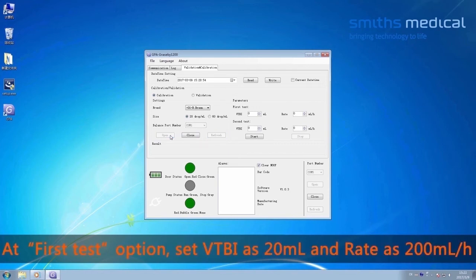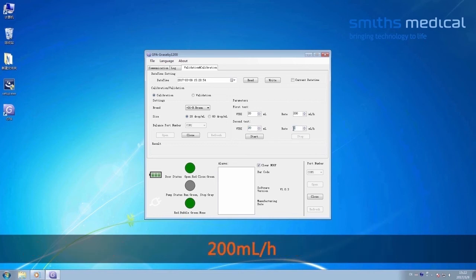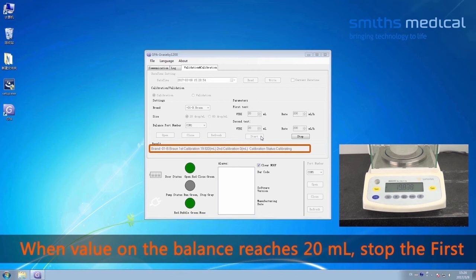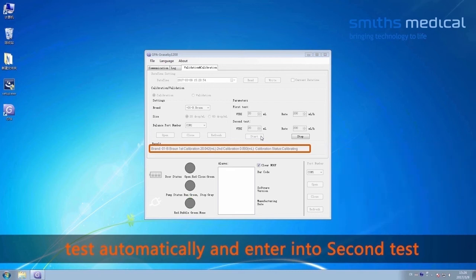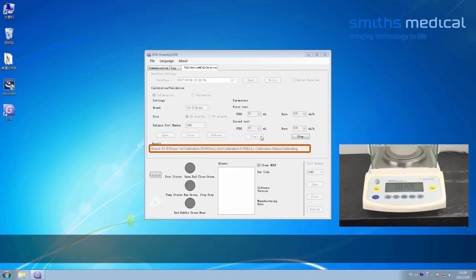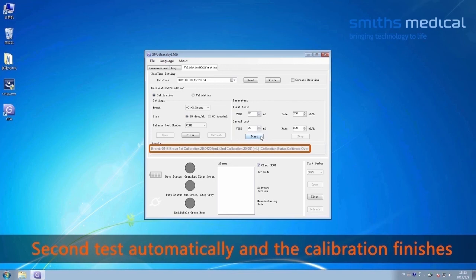At the first test option, set VTBI to 20 mL and rate to 200 mL per hour. At the second test option, set VTBI to 20 mL and rate to 200 mL per hour. Click Start to begin calibration. When the value on the balance reaches 20 mL, the first test stops automatically and the second test begins. When the volume on the balance reaches 40 mL, the second test stops automatically and calibration is finished.